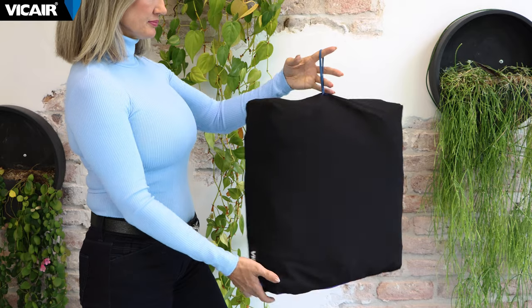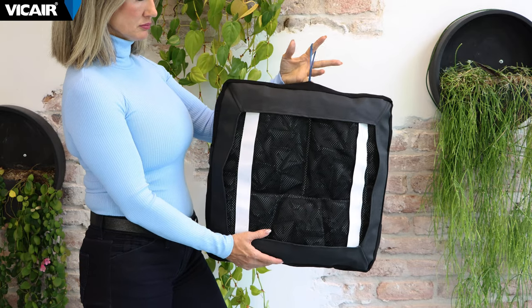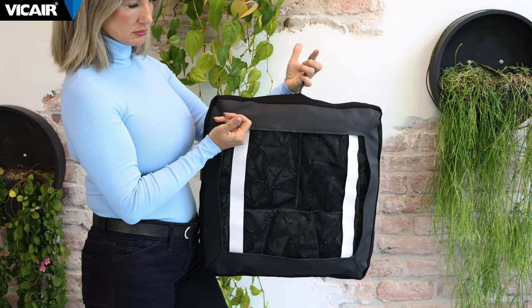The V-Care top cover is made of multi-dimensional, stretchable, breathable, and heat-dissipating material. It covers the top part of the wheelchair cushion, leaving the bottom partially open, which allows the cushion to continue to breathe and dissipate heat and moisture.